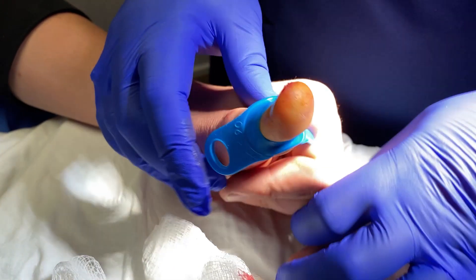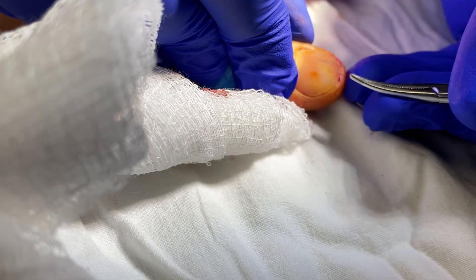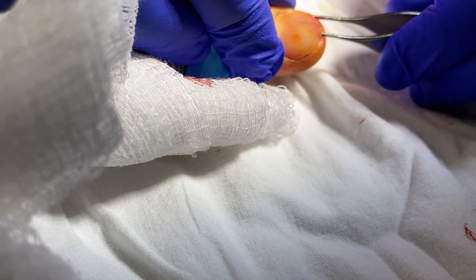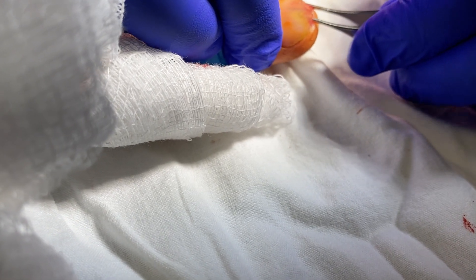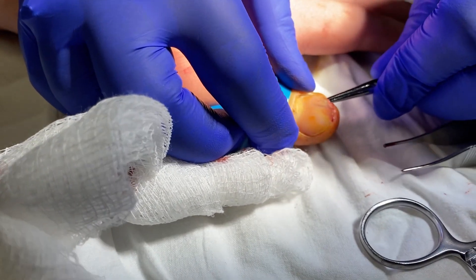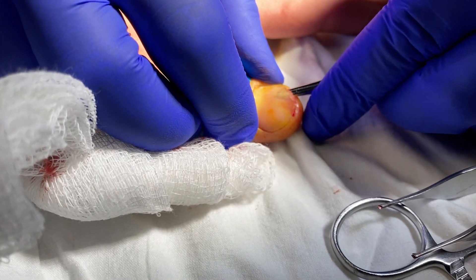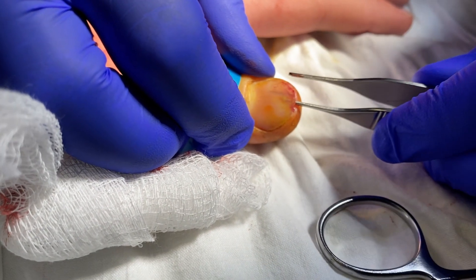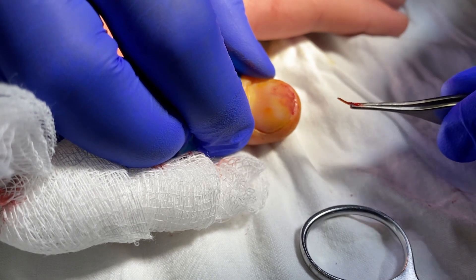Do more blunt dissecting on both sides. You've got to lift that nail up — there you go, now you're getting there. You have to open that up without breaking the glass fragment. There you go. You know your nail's going to be purple tomorrow. There we go.